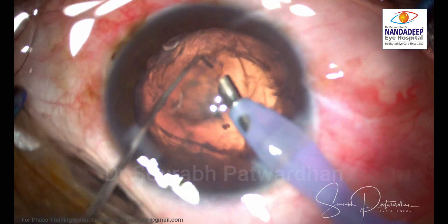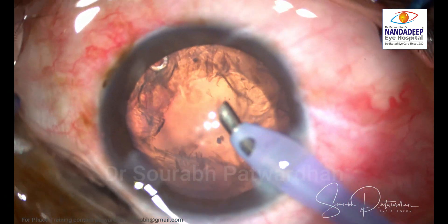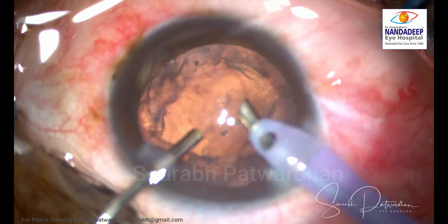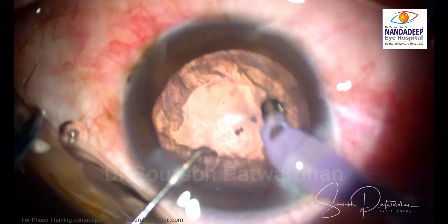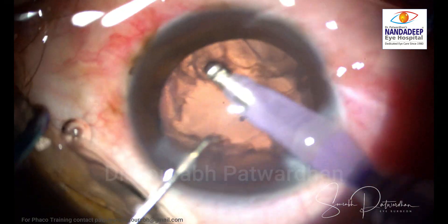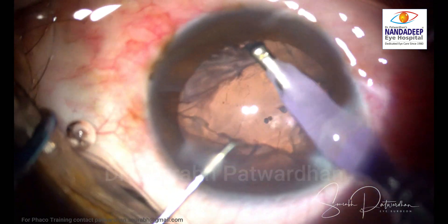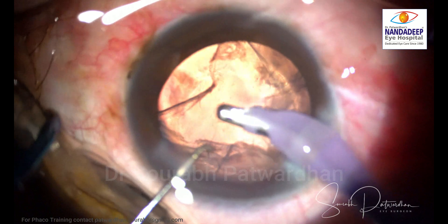During this procedure you have to make sure the bag is well supported by the CTR. In cases of more subluxation you can use capsular hooks. It is now routine to put OVD and then take out the phaco probe to avoid vitreous prolapse due to collapse of the anterior chamber.